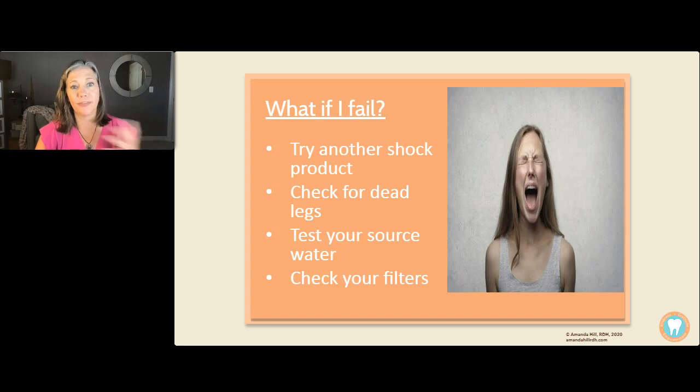So what do you do if you fail? Like, I just recently failed, right? So try another shock product. Go back through, shock again. Check for dead legs. I talked about that a tiny bit, but a dead leg is a line that you just don't use very often. Maybe in your hygiene room, you have a line that you can hook a handpiece up to. Well, if it's something you're never going to use, have your tech cap that off and dry that out.